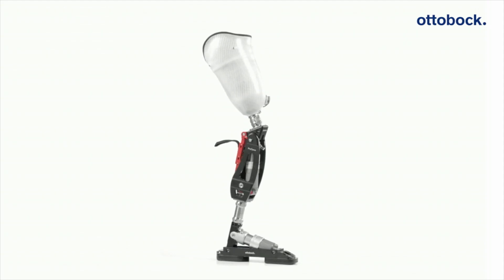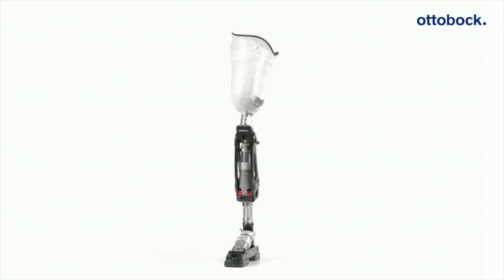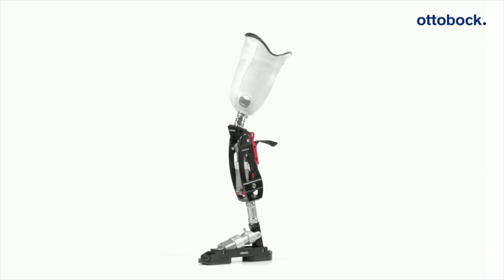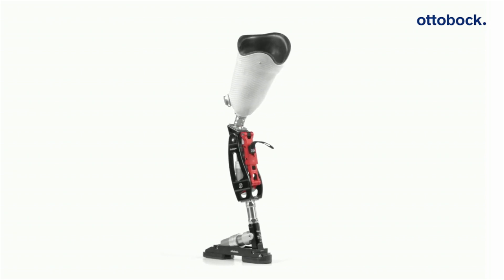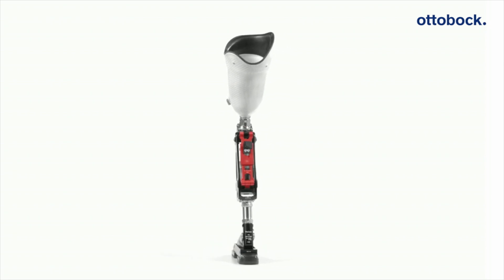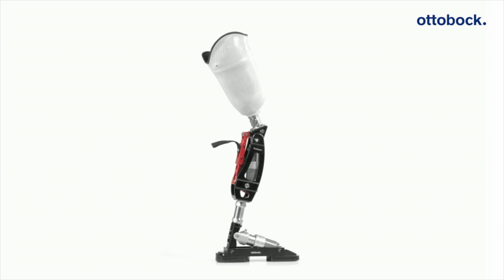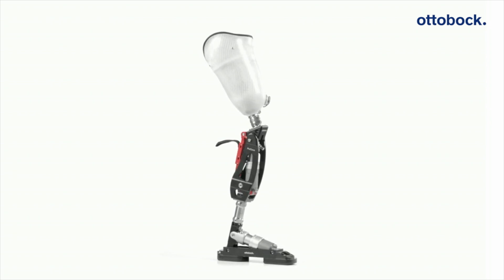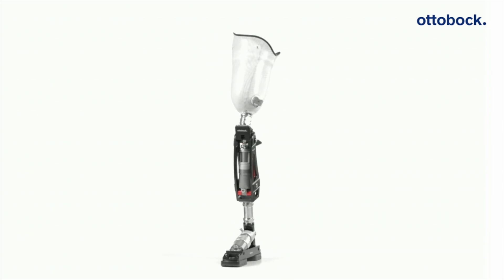The Pro-Carve is a sports prosthesis for recreational and professional athletes with lower limb amputations. It creates targeted support for skiing, snowboarding, and other sports with similar motions such as wakeboarding or water skiing. The foot and knee combination is suitable for knee disarticulation and above-knee amputees, while below-knee amputees can take advantage of the Pro-Carve foot component.